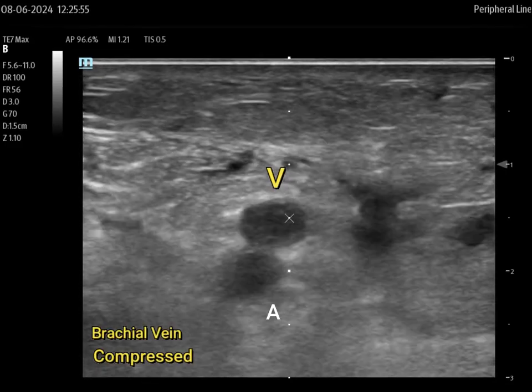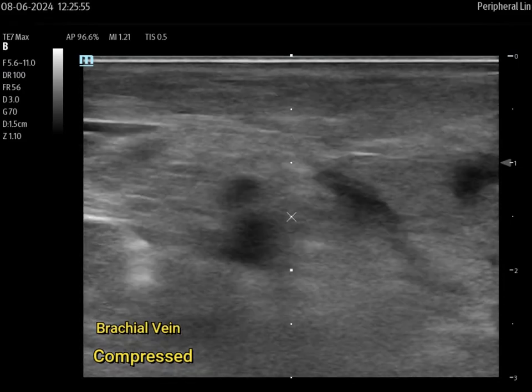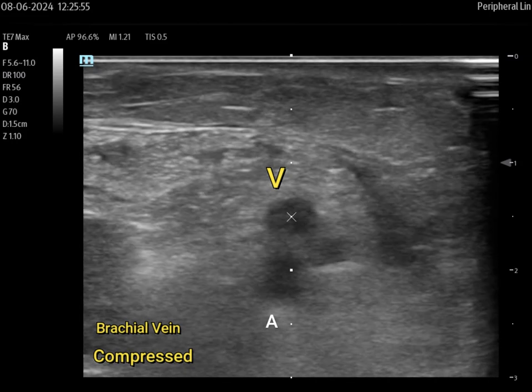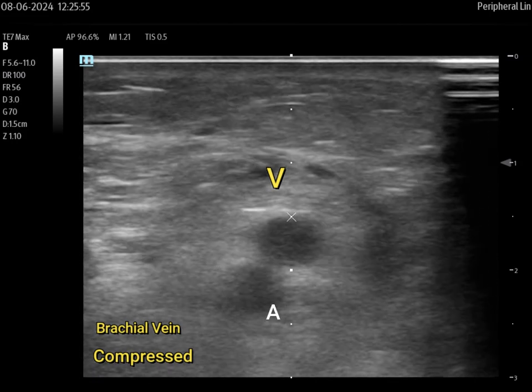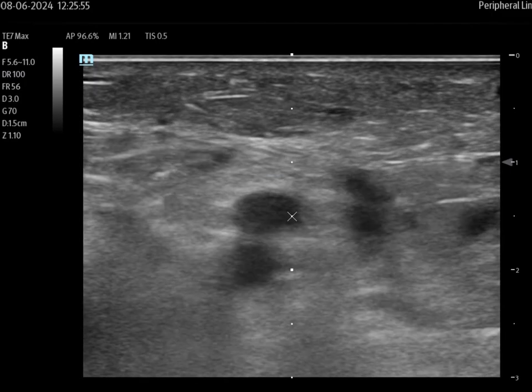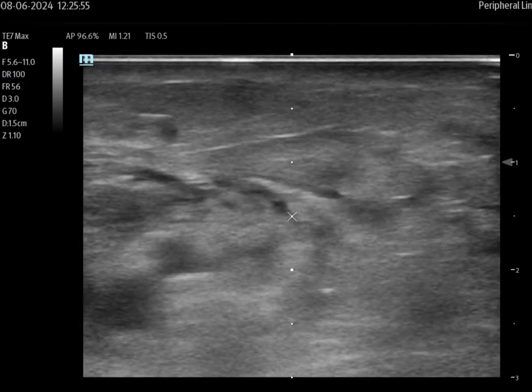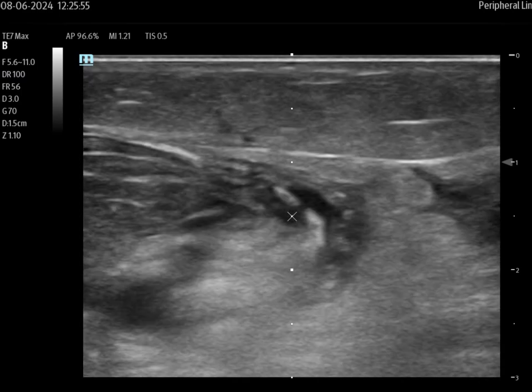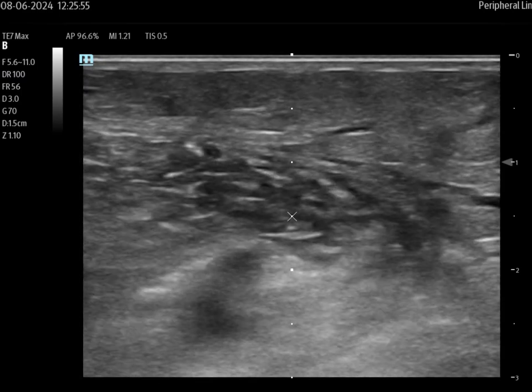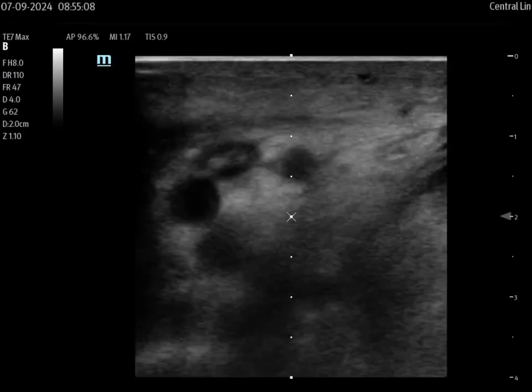Right here we have the brachial vein and brachial artery — veins on top, arteries on the bottom. That is your compressed view. You'll notice that the vein is not doing anything, and when you're in compressed view, trying to smush that vein with downward pressure and all you're seeing is no compliance — and in this section of video we can see there are actually bifurcations adding to the brachial — we know there's a problem. This is something we're going to want to bring to the attention of the providers, the MDs, and you're going to want to hold off placing a line in that arm until you get a formal Doppler.